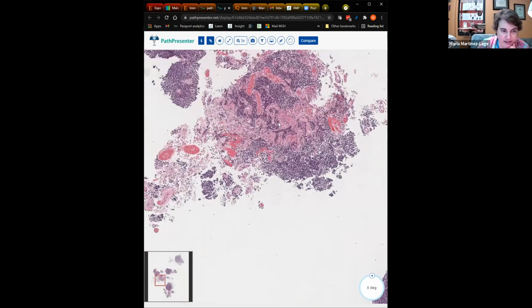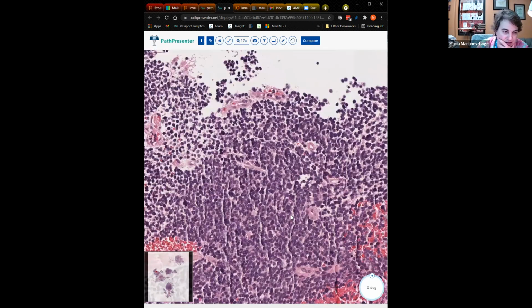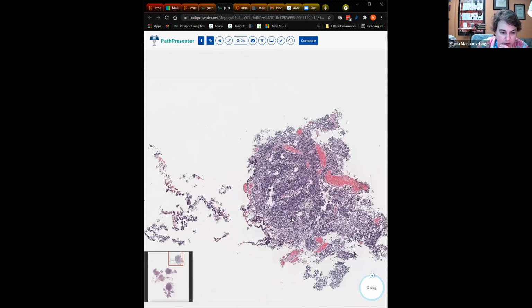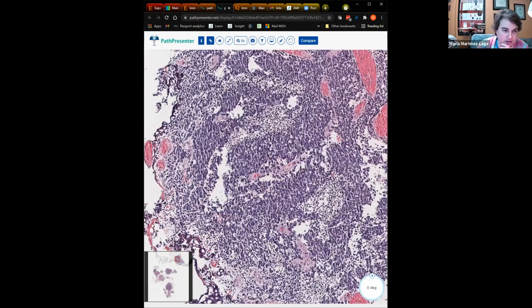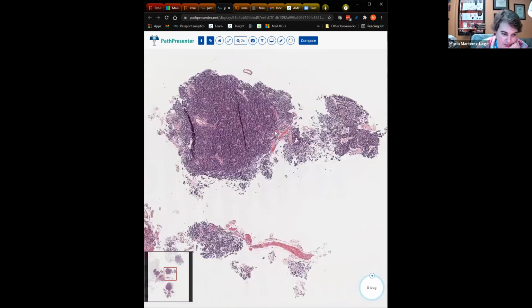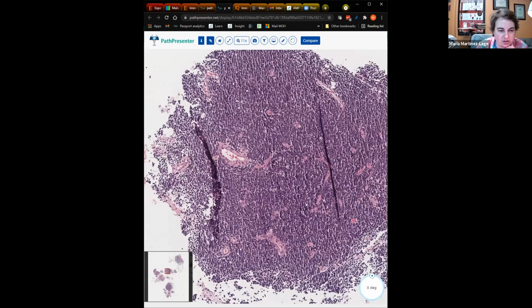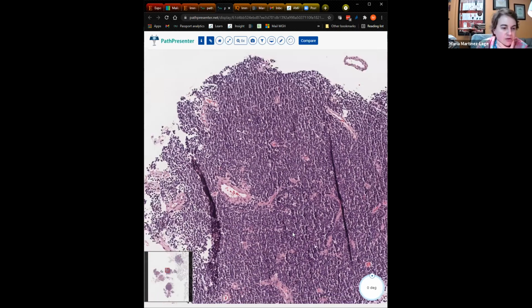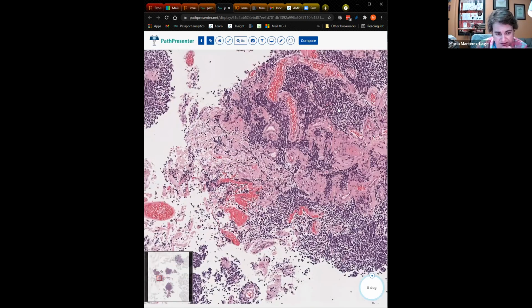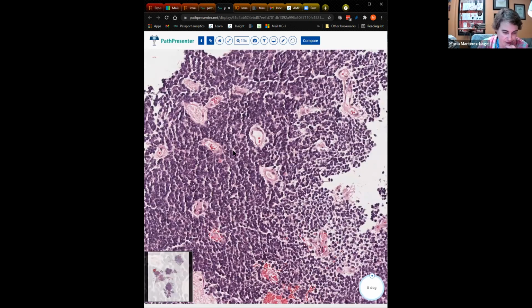Medulloblastomas are, in that sense, not very difficult to identify because you usually have, again, a child, a small round blue cell tumor in the right place. There are a number of things that we need to do to come to the diagnosis of medulloblastoma these days. One is histology. You can occasionally see necrosis, you can see increased apoptosis, all those things are in the diagnosis of medulloblastoma. You want to maybe confirm that this is the neuronal process, for example, or a primary lesion of the area as opposed to a metastasis. Well, you can do synaptophysin, which usually will stain the majority of the tumor cells. You could do, if you want to, but it's not necessary, GFAP that usually highlights only background astrocytes rather than the tumor cells themselves.